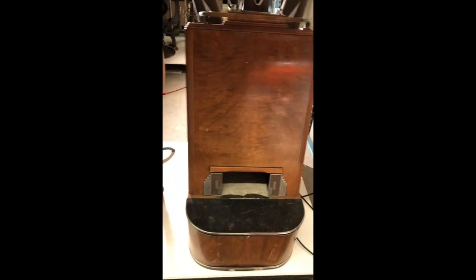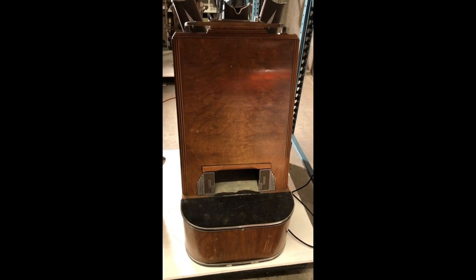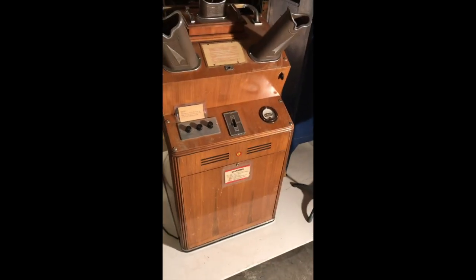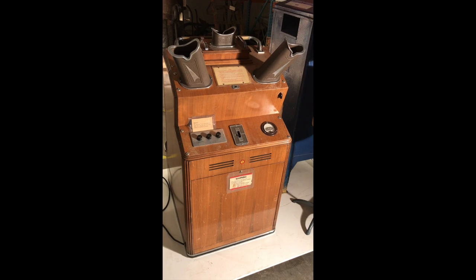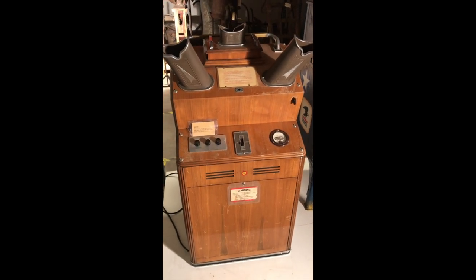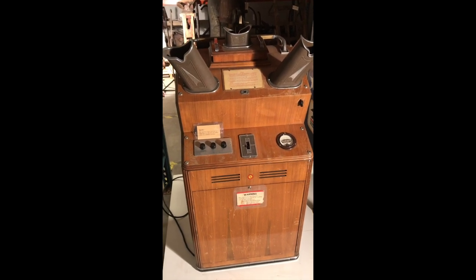So there you go — a Simplex Shoe Fitting Fluoroscope. If you have any questions on this device, feel free to email me or give me a call. If you have any recollections of using one of these, we'd love to hear from you. One of our volunteers remembered using this exact device in the late 1950s at a shoe store here in Cheyenne, Wyoming. If you have stories to relate, or know a shoe salesman who worked with these, we would love to get their history to add to our files so we can better tell the story of its use when we put it on exhibit.